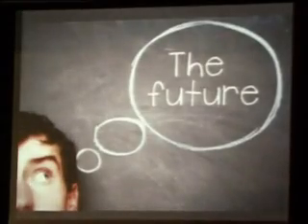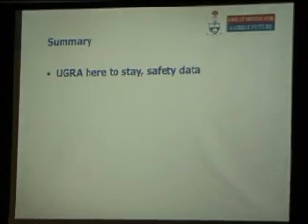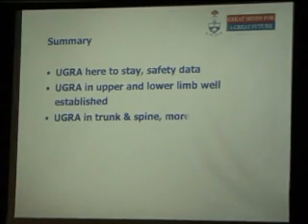So if you ask me what the future is, I think the future is bright. I believe that ultrasound is here to stay. It's just a beginning here. I think in 5 years' time, you will agree with me that it is here to stay. You would find that once you use it, it's very hard for you to not use it. For upper limb and lower limb blocks, I think it's very well established. It's not really a big challenge to us anymore, except the sciatic nerve that is deep.